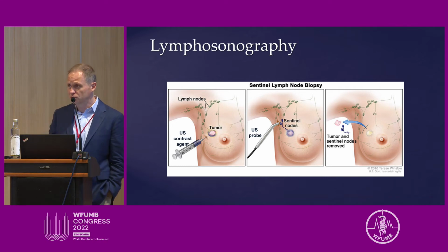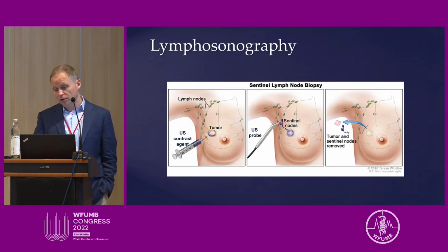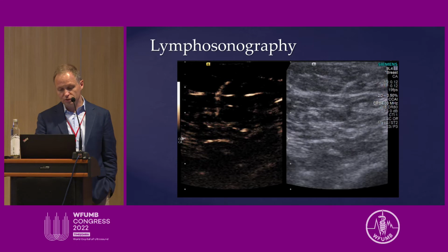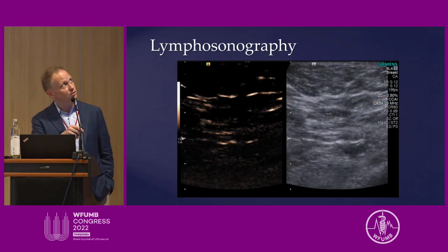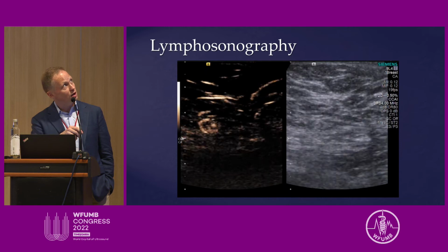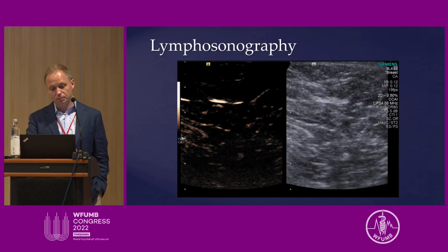We don't want to disturb microbubbles. We don't want to break them. And with high-frequency linear transducers, you will be surprised to see those lymphatic channels appearing, radiating from the side of the injection, guiding you straight into sentinel lymph nodes.